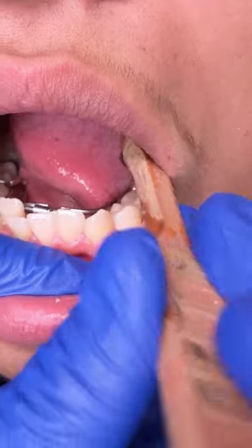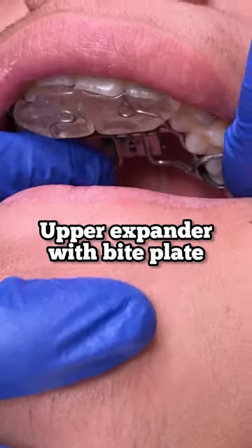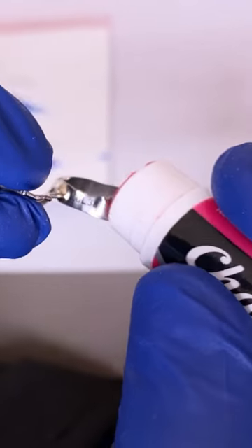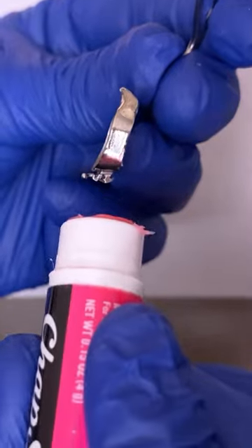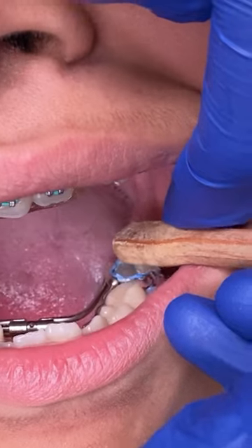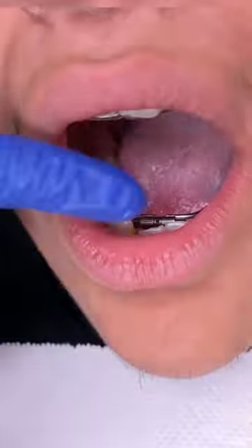First step, we're going to go ahead and make sure that these appliances seat correctly, which is coronal to the tooth. Here we're applying some chapstick to the openings of the wire insertion to make sure that none of that Fuji gets blocked or clogged into those ducts.